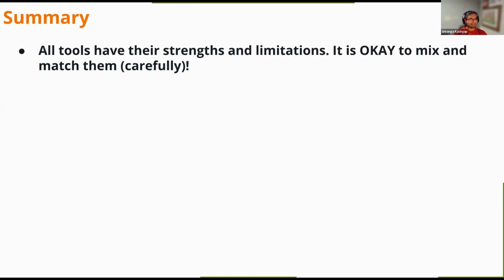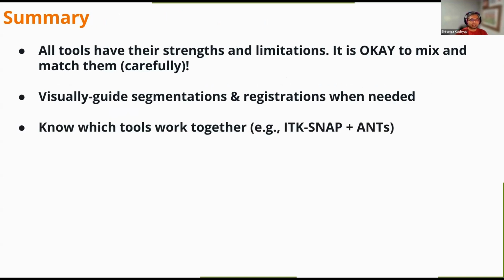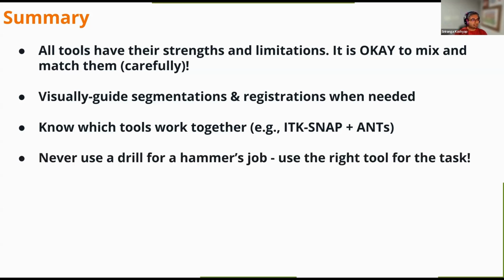Okay, to summarize, all tools have their strengths and limitations. It's okay to mix and match them, but very carefully. Visually guide segmentations and registrations when needed, nudge the algorithms along, know which tools work together. ITK-SNAP and ANTs, FSL, FreeSurfer, I don't know. See if they can use each other's transformations.